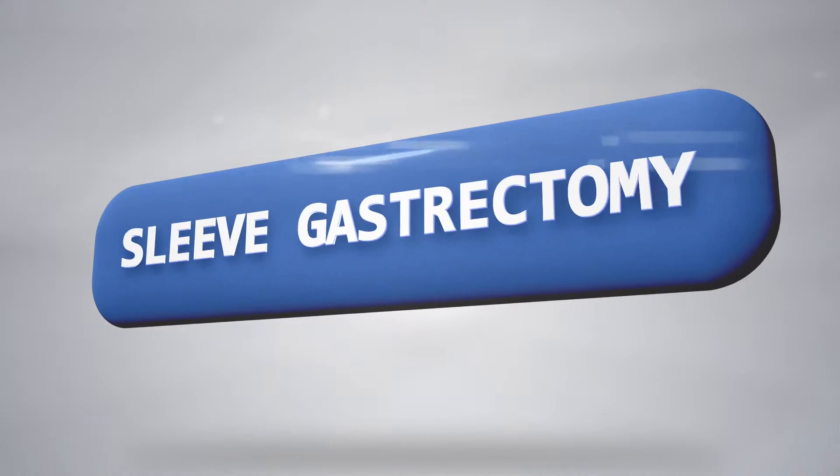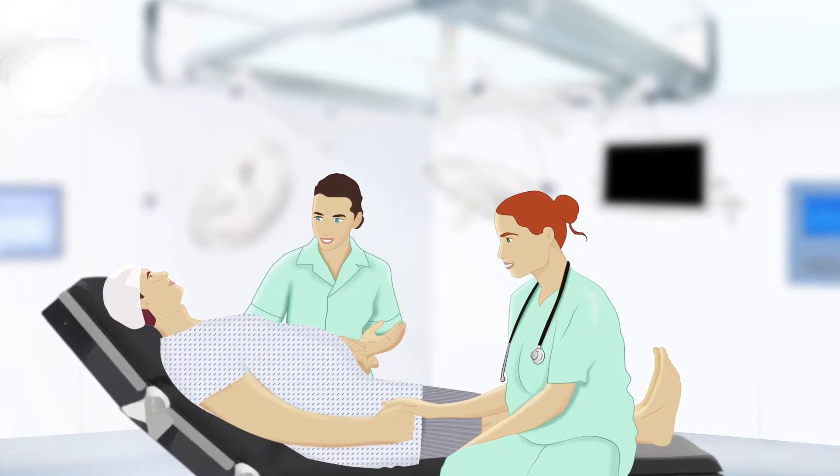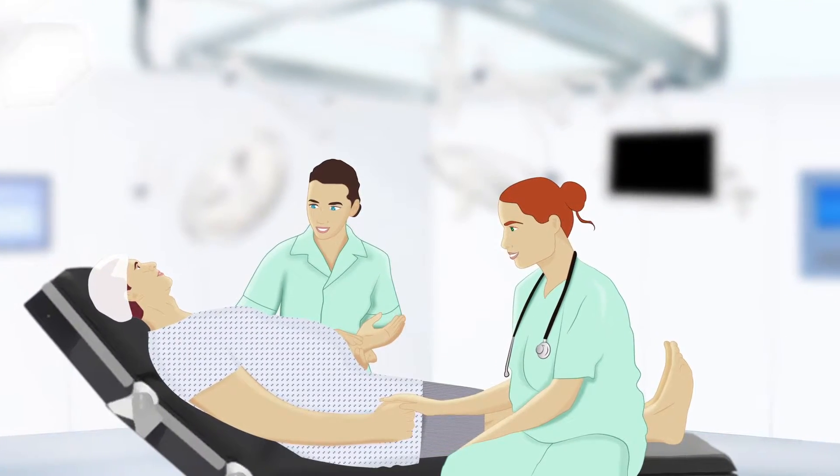A sleeve gastrectomy reduces the size of the stomach, which restricts the amount of food that can be eaten. The patient is positioned safely and securely on the operating table.